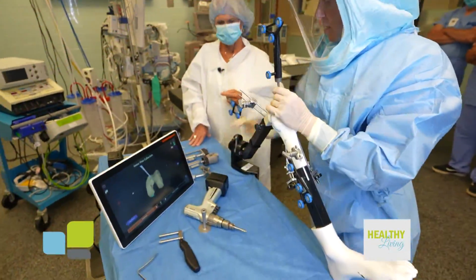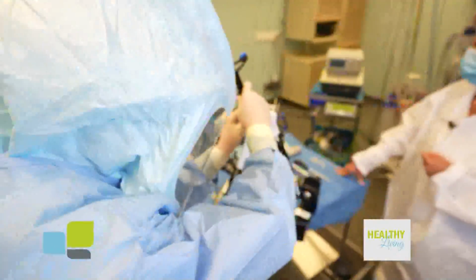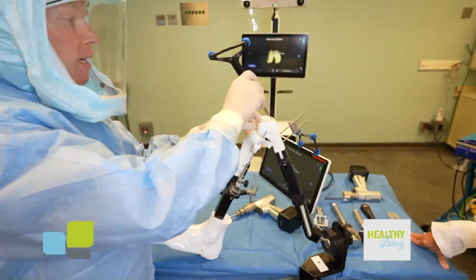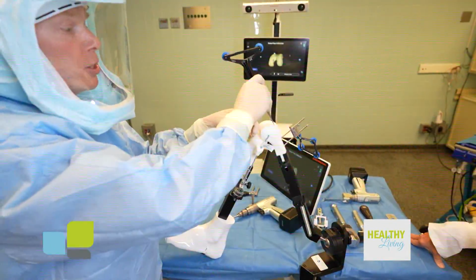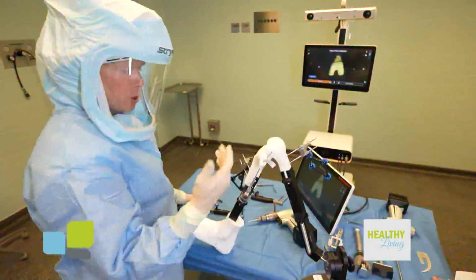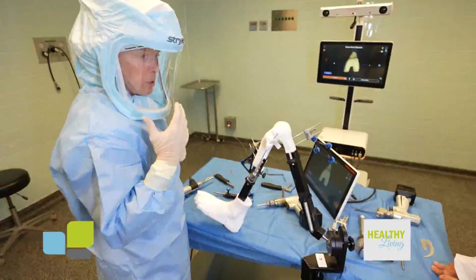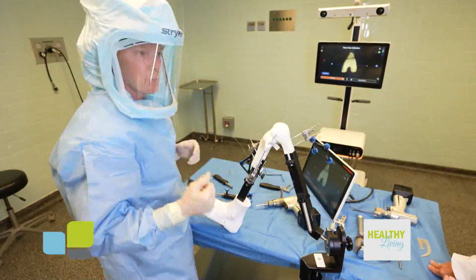Yes, we're going to get the back of the knee now. So now this patient would be asleep under anesthesia, not awake, with a nerve block to assist with post-op pain, and would also have a special cocktail injected at the conclusion of the operation. I inject the soft tissues with a special pain cocktail to minimize postoperative pain, which is part of what accelerates the recovery and minimizes postoperative pain.